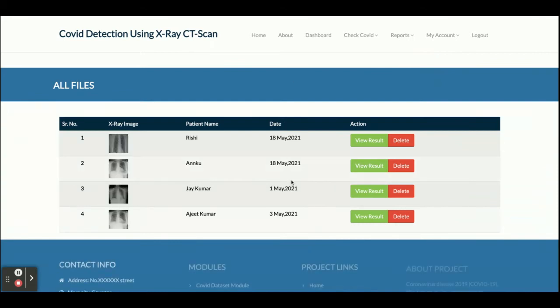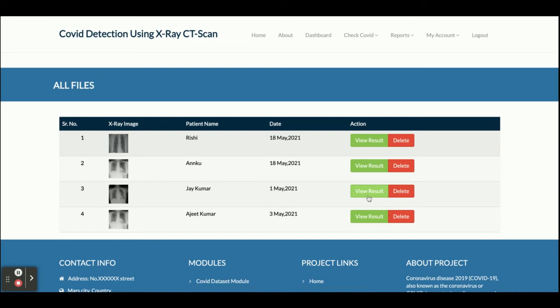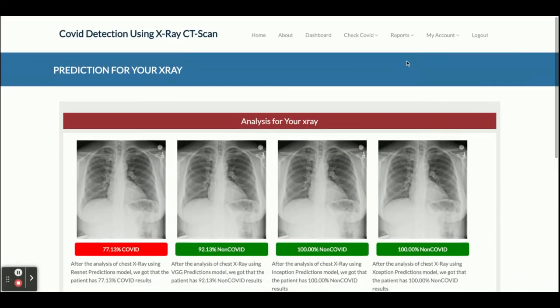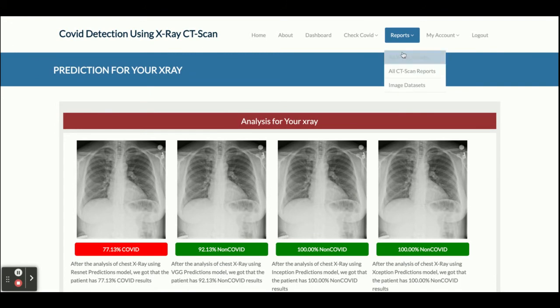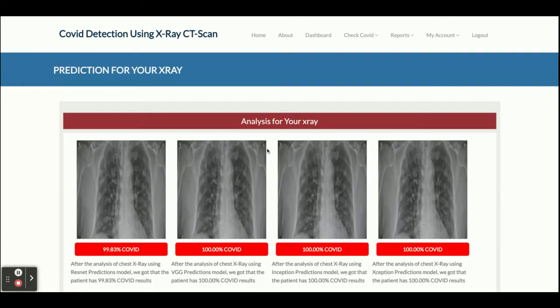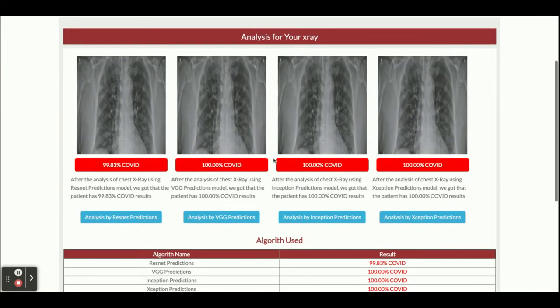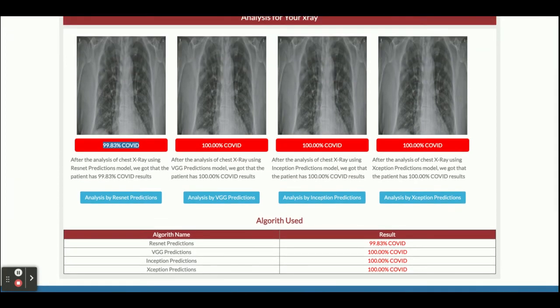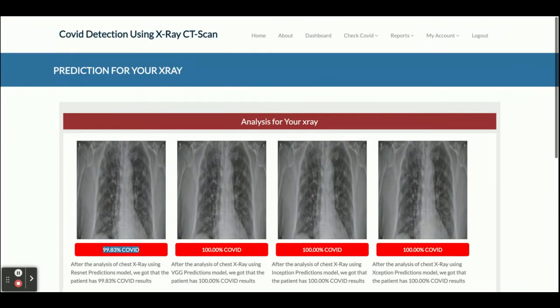Now I'm going to the 'All X-ray Reports' section. You can see all past X-ray reports here. You can click 'View Results' and it will show you all previous results. I have performed some other analyses also — you can see one showing 100% COVID, and another showing 99% COVID with all other models saying 100% — meaning that patient has 100% COVID symptoms.